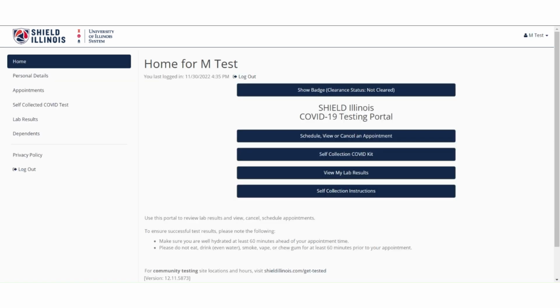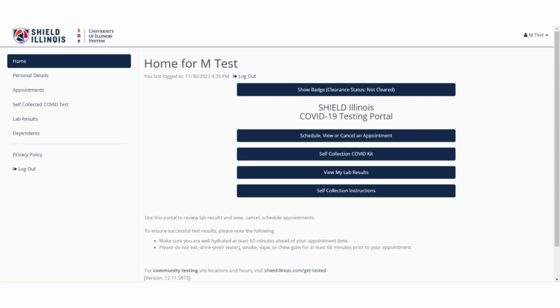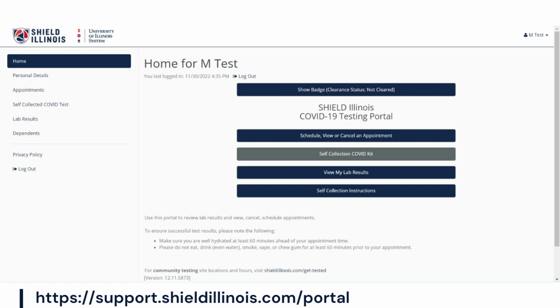Upon login, you will see the main menu. The second option will be a button for Self-Collection COVID Kit. Click on this option to register your saliva sample. If you do not have this option, you will need to add the agency you are attempting to test with to your account. Instructions on how to do this can be found on the Shield knowledge base.